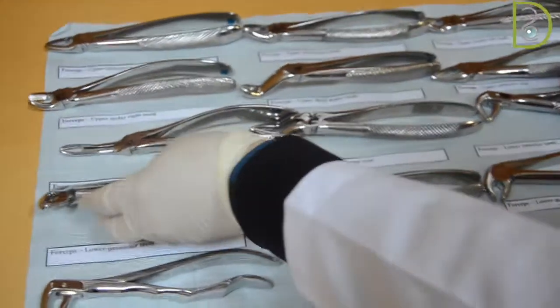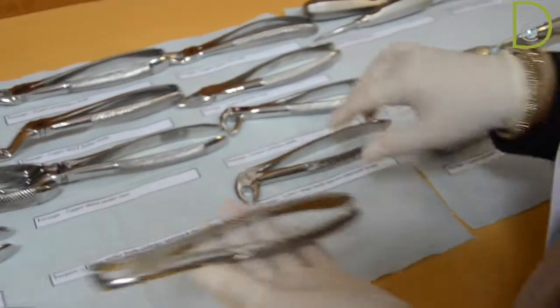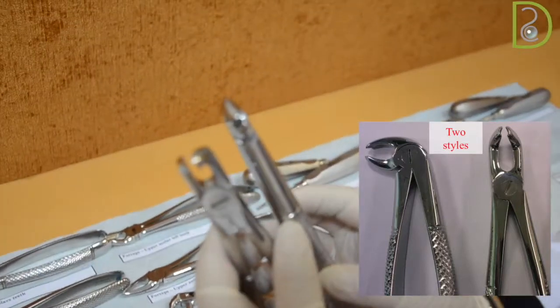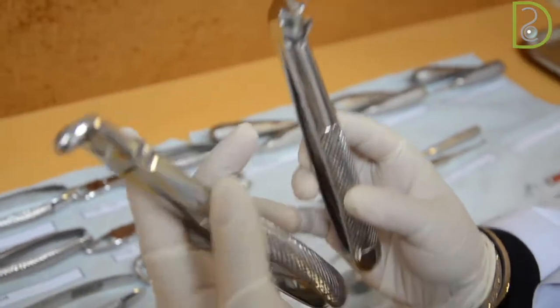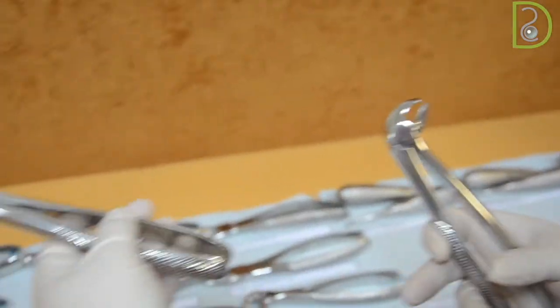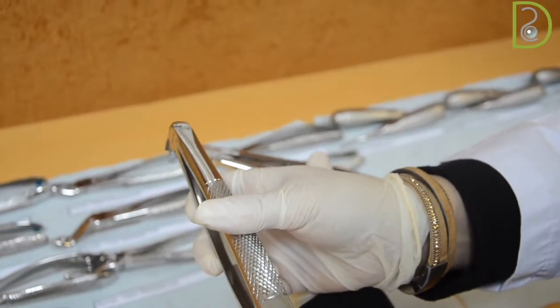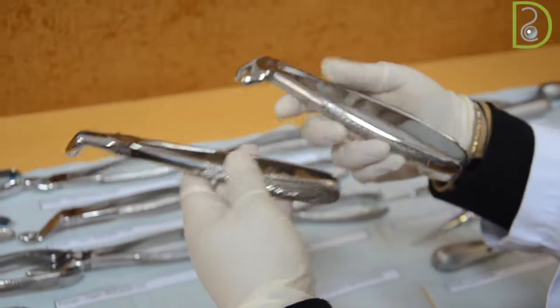Now we will talk about the lower molar teeth. Lower molar teeth have two kinds of forceps. There is the anterior approach design, and there is the lateral design. Looking at the beaks, both beaks have some projection, since the lower molar teeth have two roots. The difference between them is that with one, you will go from the most anterior portion of the oral cavity towards the posterior, and that's why it's called the anterior approach design. This is the lateral design, the one that will approach the molar from the lateral position, that means the outer position. That's the difference between them.